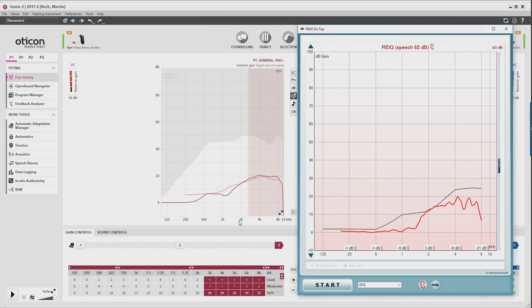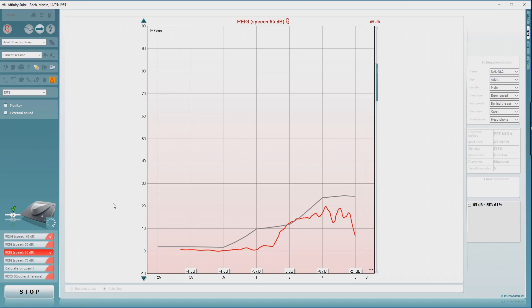So let's go ahead and fine-tune this hearing aid now to get a target match. Let's run a second measurement and see how well we've matched our target. Okay, so that's a much better target match than before.